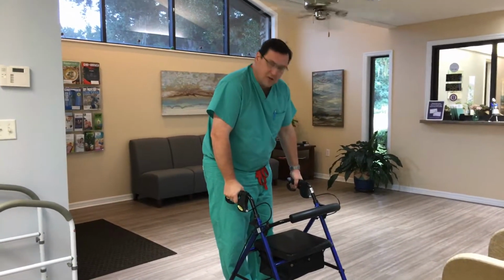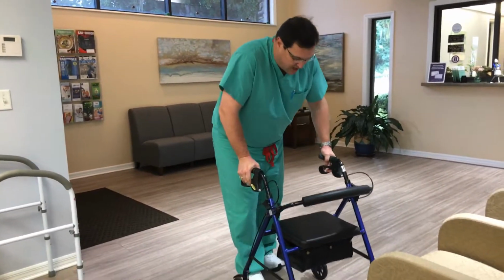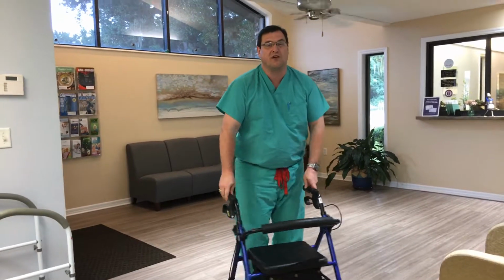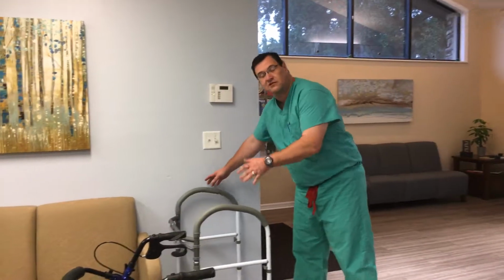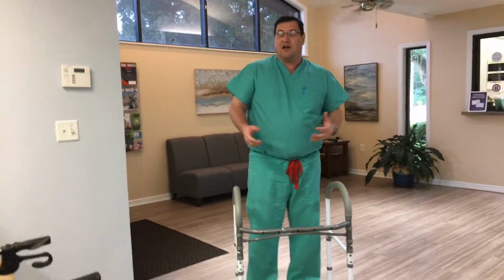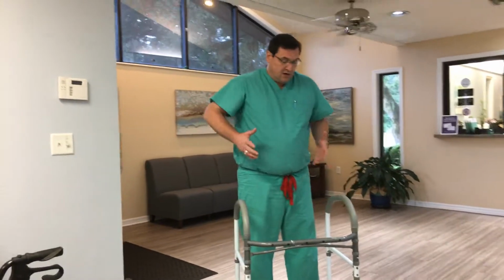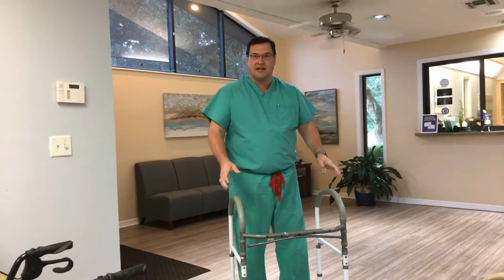The problem is if you're not squeezing hard enough on the brakes like I am, it can slide out from underneath you. So here you are, you're trying, and boom, you fall, you've re-injured yourself, you've had problems. So I'm not super fond of the one with wheels and the brake. It takes a lot of coordination, and if you have that coordination and the strength in your hands, you're young, you're healthy, it's fine, you can use a walker. But if you're young and healthy, you're probably using crutches, and you can look at the video that we have on utilizing crutches. So usually when you're using a walker, you're a little older, you don't have that hand strength, especially if you're a female, you may not have the hand strength to hold that brake and keep it from sliding out from underneath you.